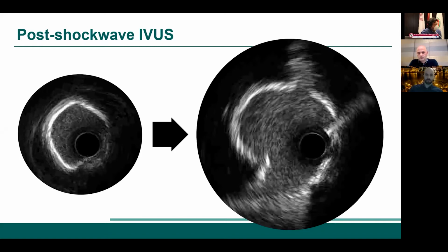We're not going for more high pressure balloon, because really every time I use a high pressure balloon or other devices with high pressure in an 81-year-old male, I think twice with our situation in Lebanon, any rupture of the vessel. I have to think directly to the algorithm. Rotablation is less risky for the patient than going more and more for higher balloon.